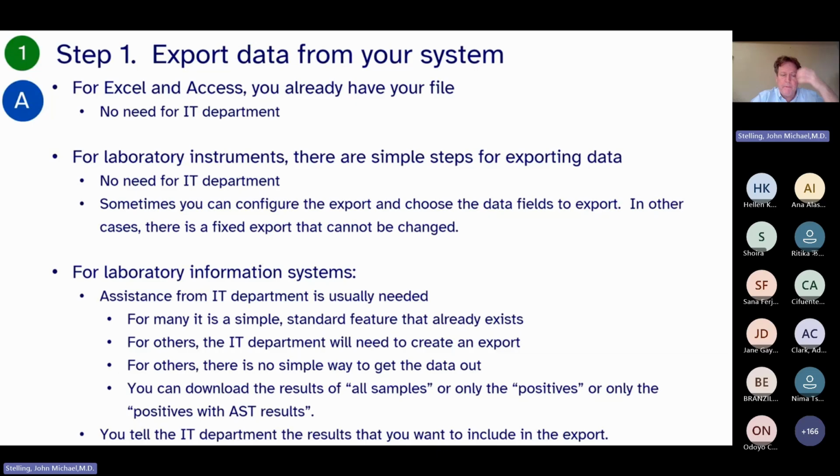The big difference is that if they put it on the screen, the lab people do it manually whenever they want. On the other hand, if they do it through the back end, then often they can schedule it and they can say, I want a report every day or every week or every month. So for these systems, it's often not a difficult thing to do, but they do have to make an export for you, and you need to tell them what you want to export, and I will come back to that.